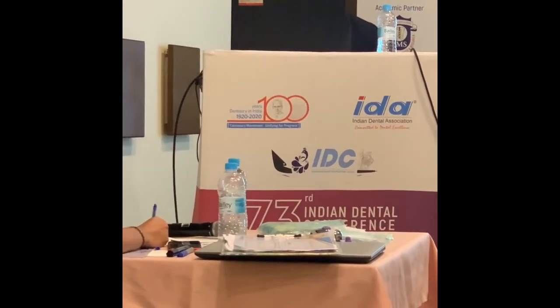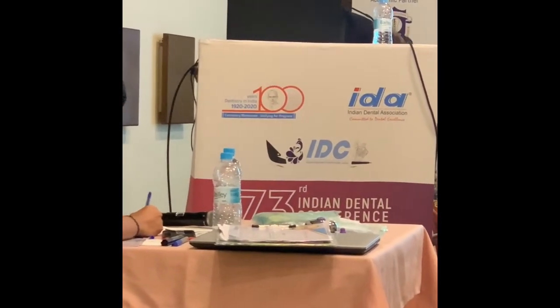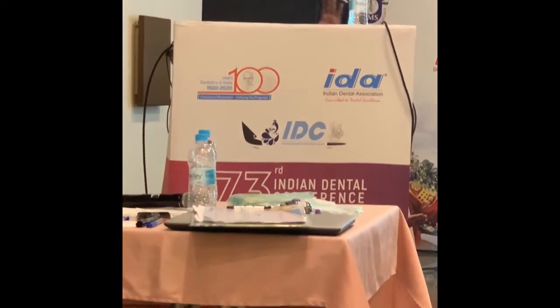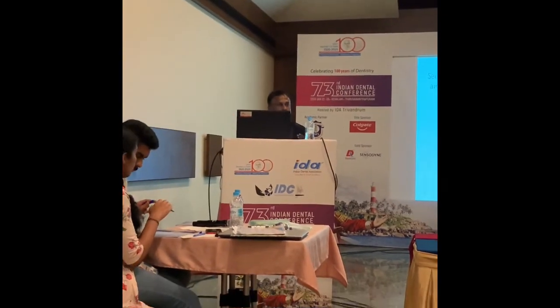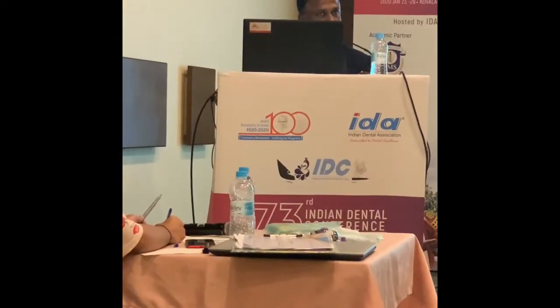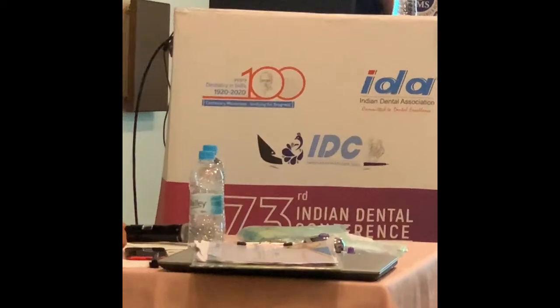So a very, very easy method to evaluate the placement of implants is to first take an impression and a dental cast. A simple dental cast is enough initially. Of course, the OPG and the CBCT can chip in later on. So once that is ready, this will give the thickness inclusive of the soft tissue and the bone together. So you can take something like a compass, the compass which has got sharp ends. You can put a little bit of LA or a topical local anesthetic, press it in and find out the thickness of the soft tissue.